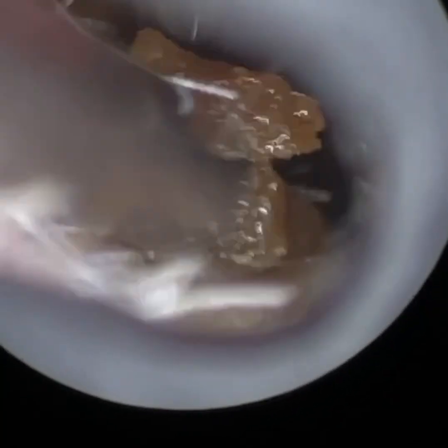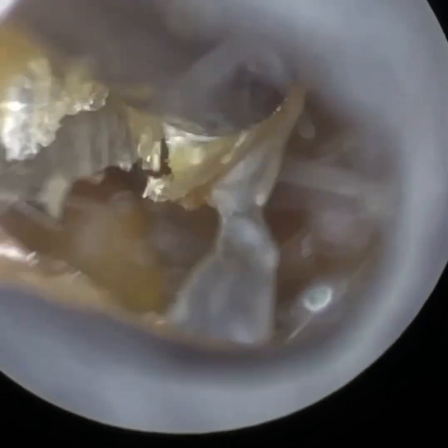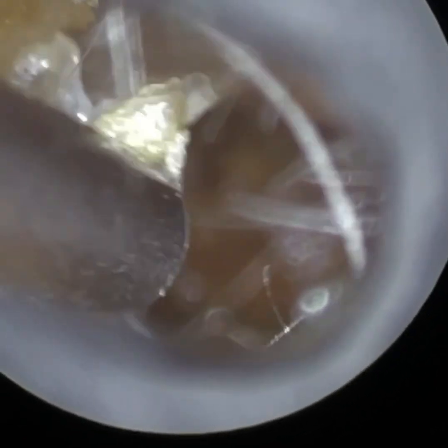Just going to stretch the ear open with the speculum. Now we're going to get this crusted skin, which is on the eardrum, in focus. I think I'm using a standard Zoellner at the moment, and we're just slowly removing that away. You can see some of the posterior aspect of the tympanic membrane is now visible. The patient's hearing would be significantly improved already because the main bulk of the occlusion is gone. But we're just going to try and remove a bit more — just removing some dead skin more laterally near the cartilaginous portion to improve the view deeper in the ear.